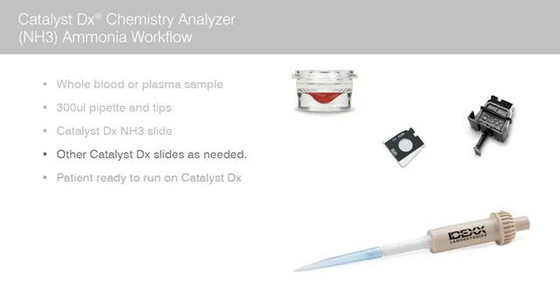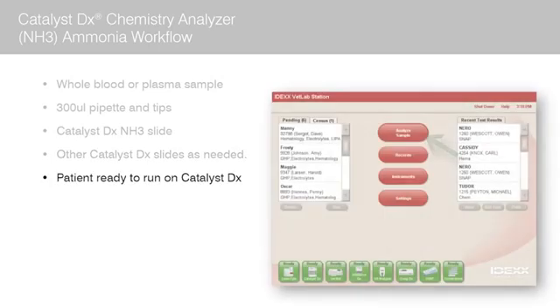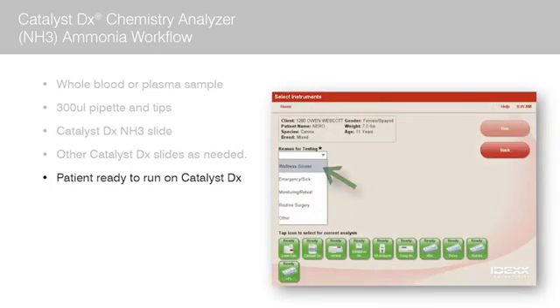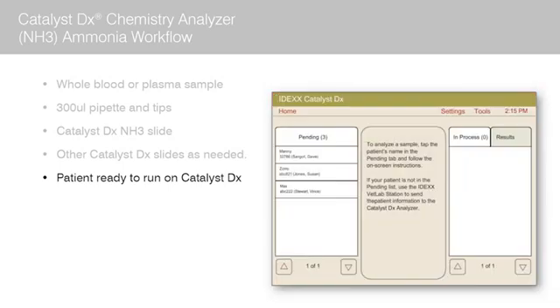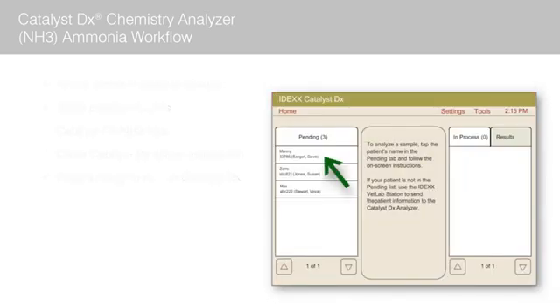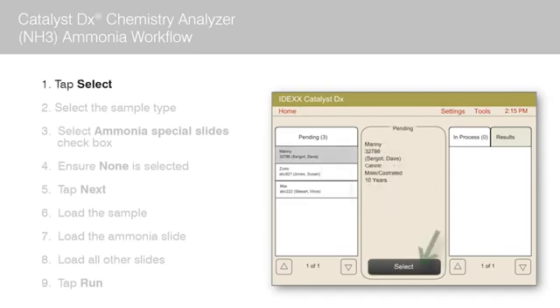For our purposes today, we have already collected the sample and initiated the run on the IVLS. Once the patient's name appears in the pending list on the Catalyst DX home screen, tap the patient name and tap Select.